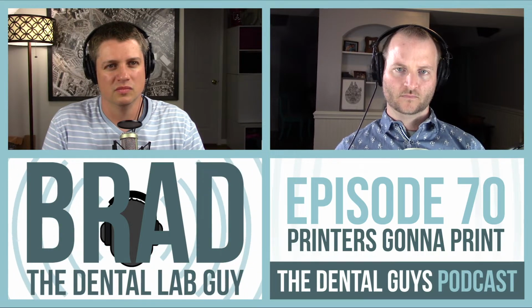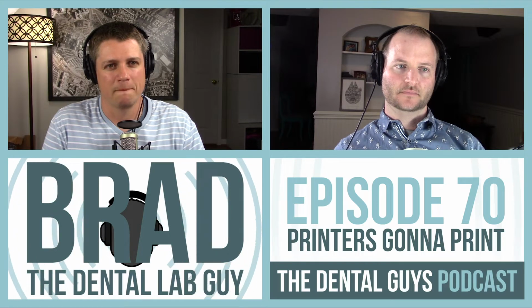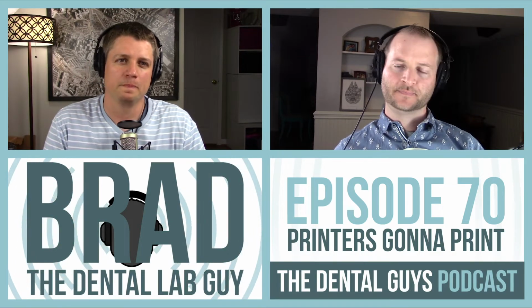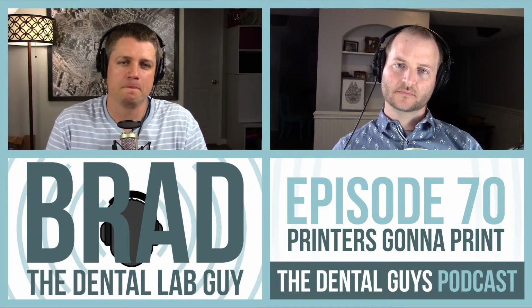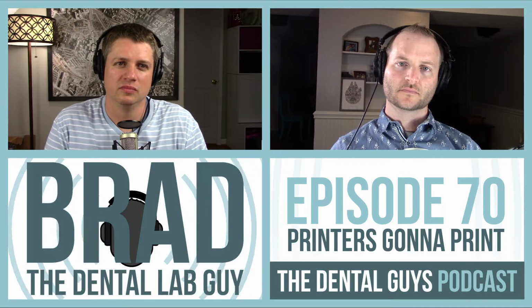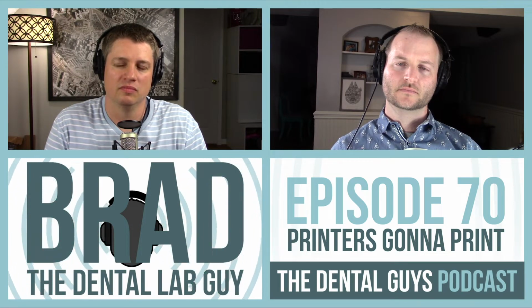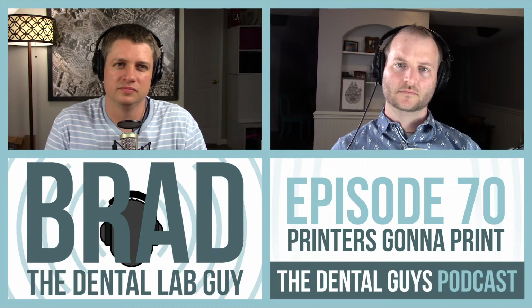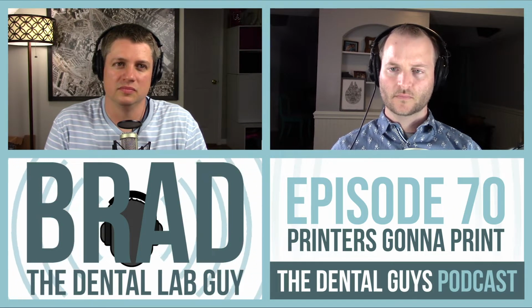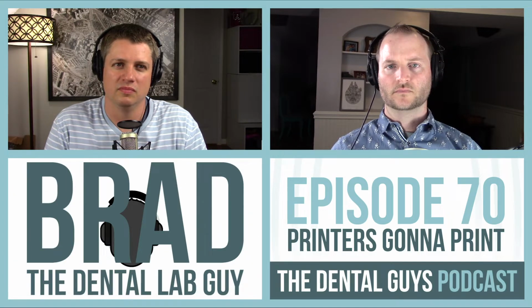And that's a moving target too, because stone itself has an expansion rate. You have high expansion or low expansion stones. So when you pour it, it changes in dimensional space. It depends on the unit you're using to print also, because of how you scale that. So that's a moving target from lab to lab. If we take our stone and use a 0.08 expansion rate on it, and compare that to a printed model, we're 98% accurate to that.